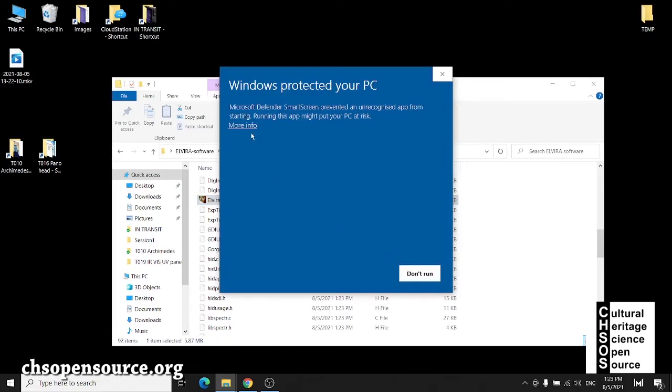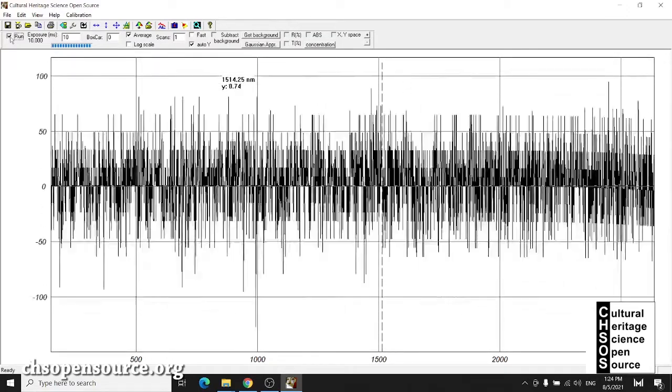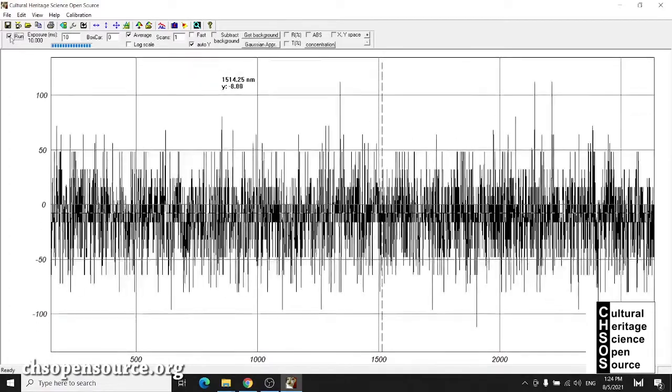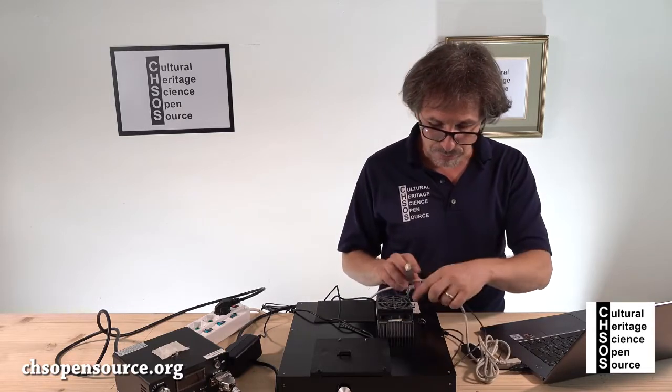Windows says it doesn't recognize the software, so you have to click 'Run anyway.' When the system is connected at the beginning, you're going to see a sinusoidal curve. This means the system is connected and recognized — everything is fine. Click on 'Run' and check the run box. You can see some measurements displayed, which we'll go into in detail later. The system is recognized by the software installed on this computer.